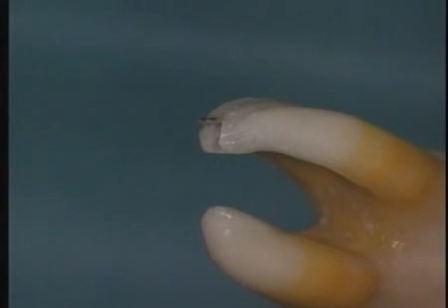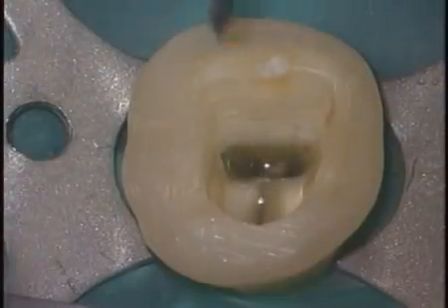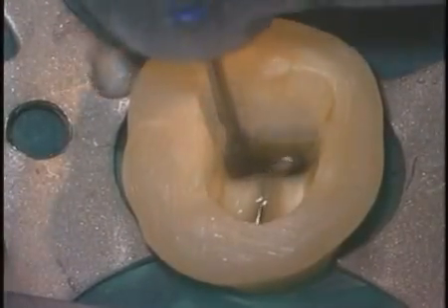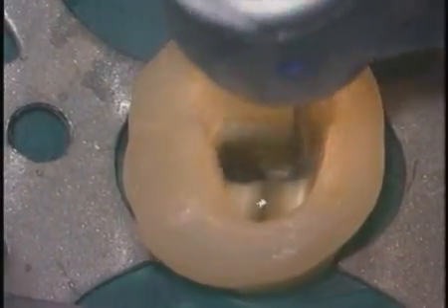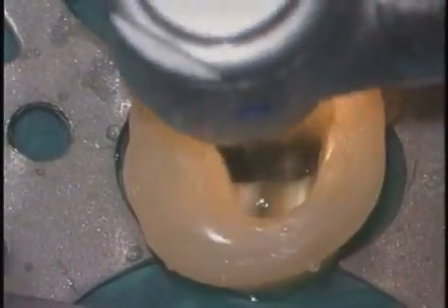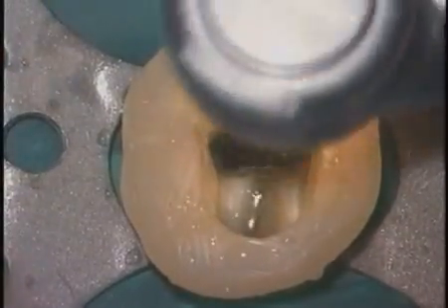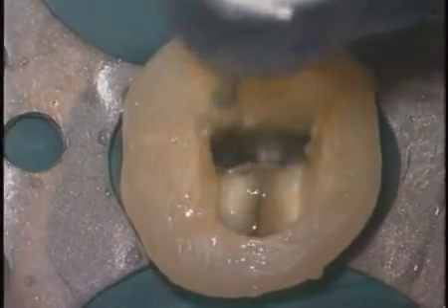You can see here the foramen has been ripped and the file now is excessively long, and this is going to be difficult to manage short of using a barrier technique. When we're going to use a barrier to pack against, we still have to do some refinement of the canals. And even though there's reversed apical architecture in the apical 1/3 of the root, we still need to do some shaping procedures in the upper 2/3 to develop a conical shape preparation to pack into.